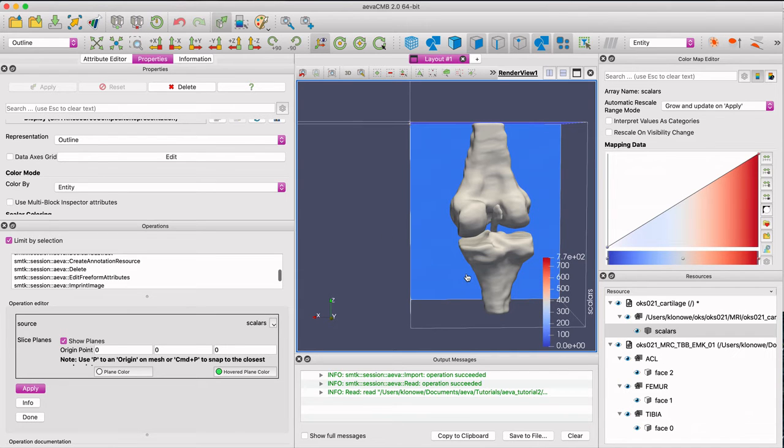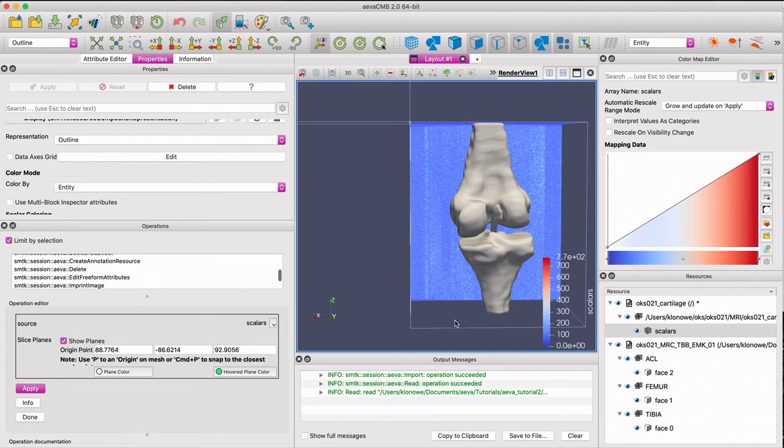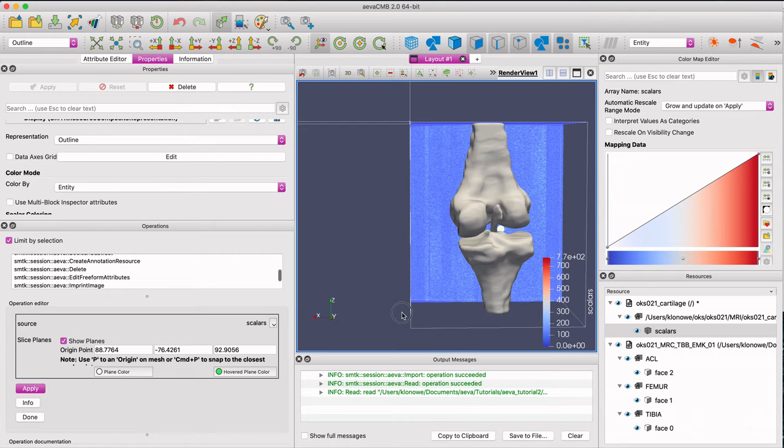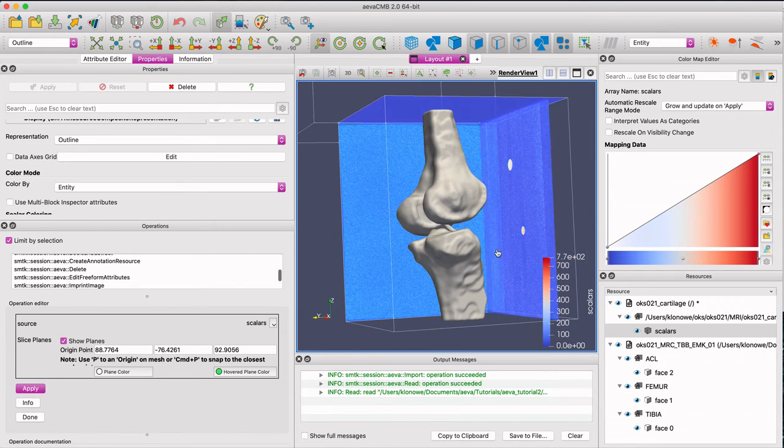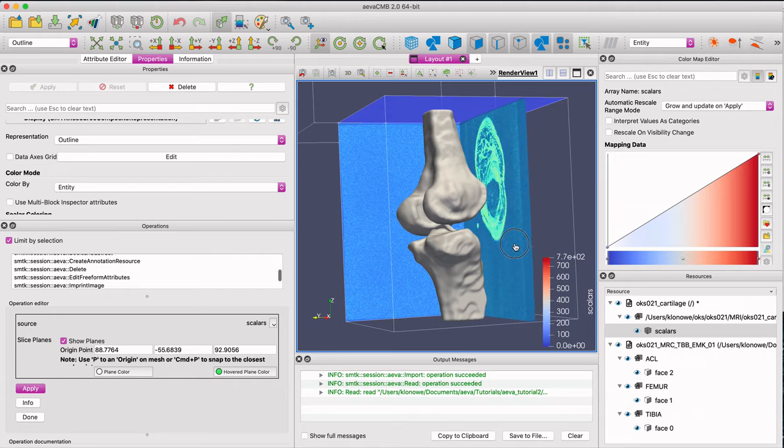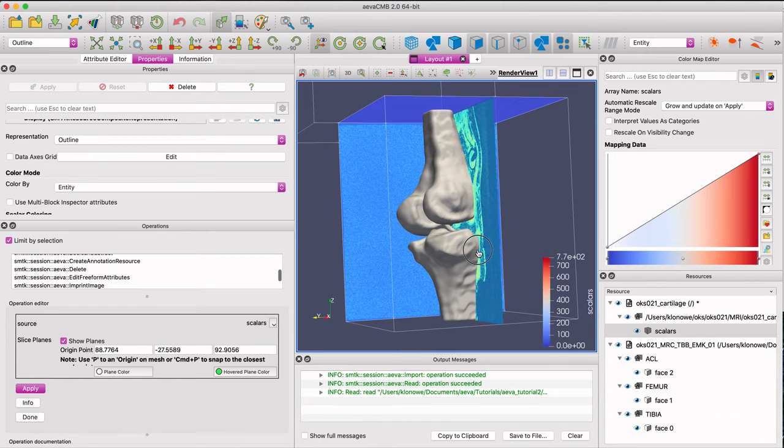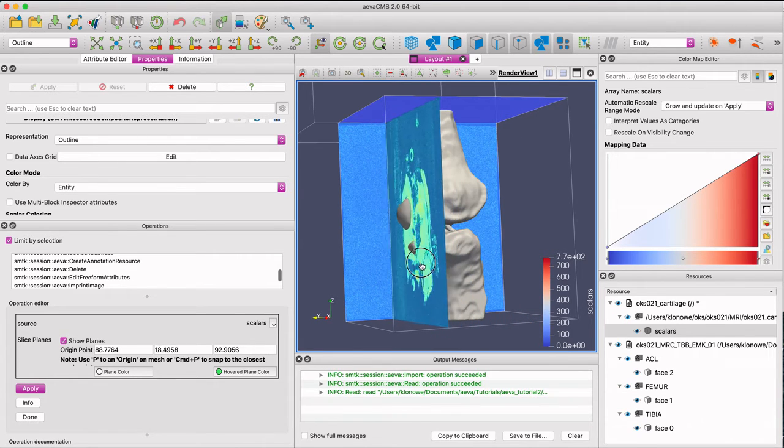This tool is useful to view geometry relative to its volume. In this case, the tool can be used as a quality check to view the insertion site of the ACL on the femur and tibia.